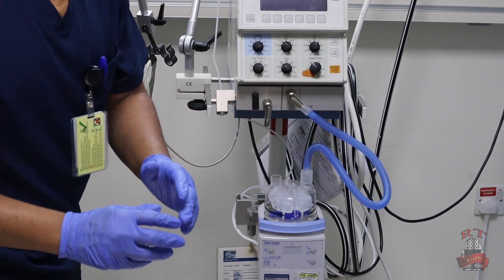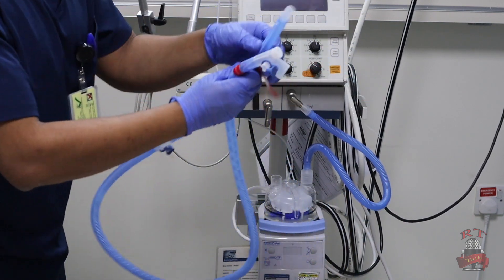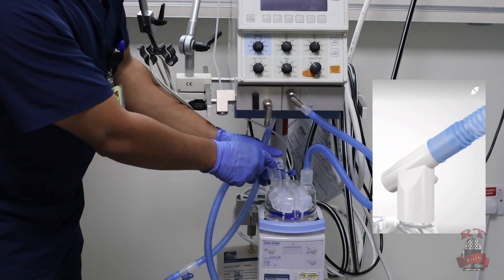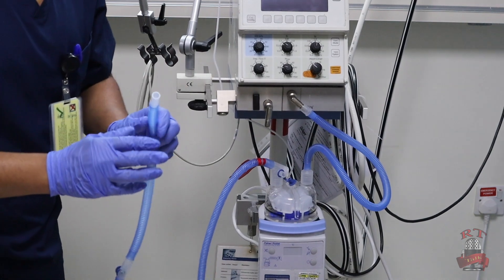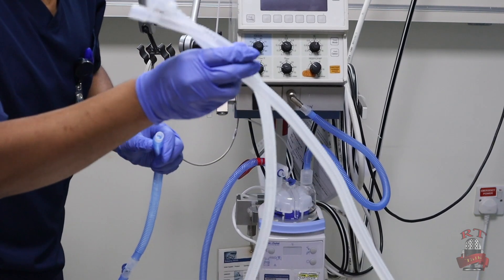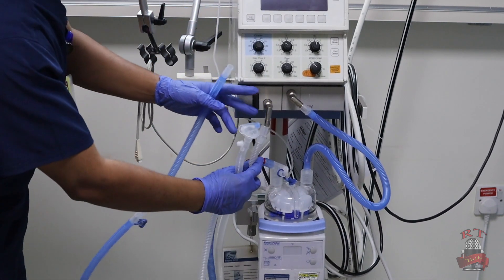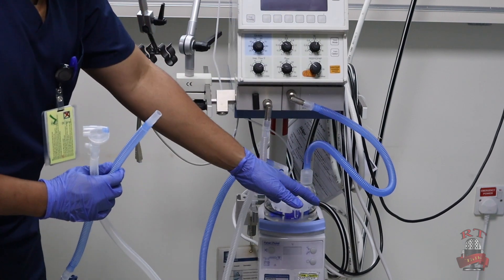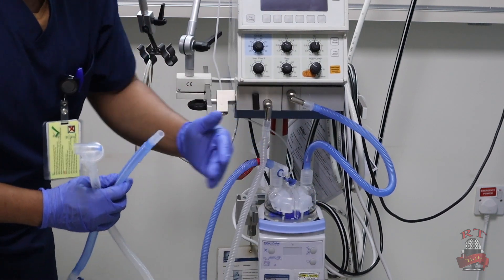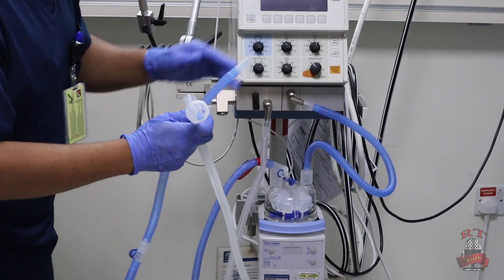After this I will take the other inspiratory limb — the long one — and I will connect it on the other side of the humidifier. Then I will take my expiratory limb — the white one — and I will connect it in the other adapter going to the machine. So the blue one is the inspiratory limb coming from the machine, going to the humidifier, then to the patient. The expiratory limb comes from the patient and goes back to the machine.